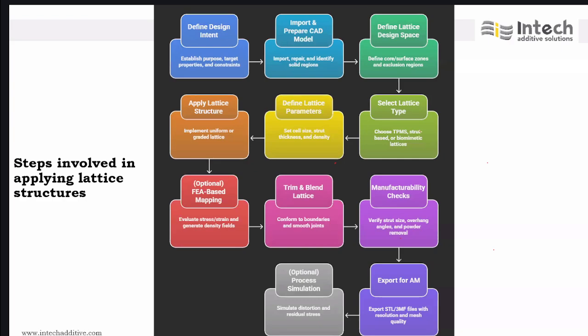If you say that you don't want a lattice structure there, you have to inform the software that it's going to be an exclusion region. And the fourth step is an important step.